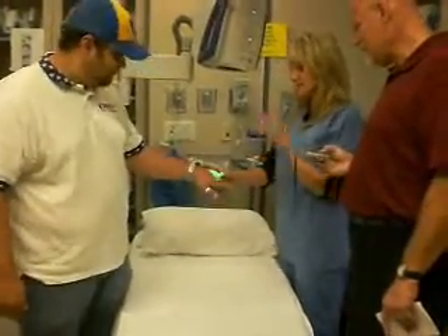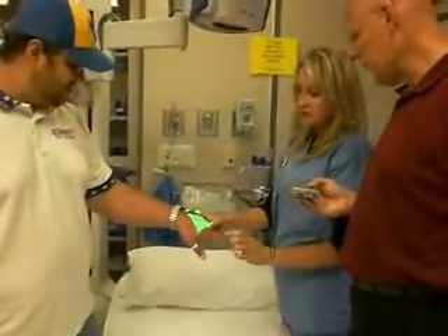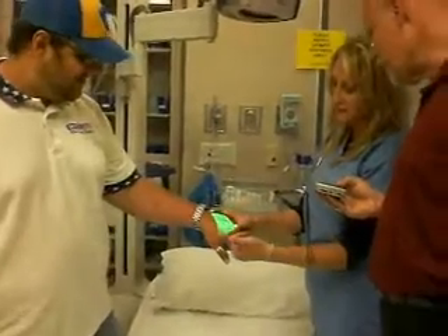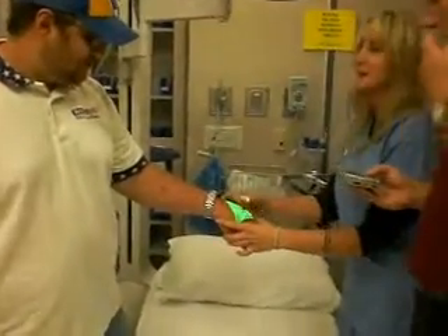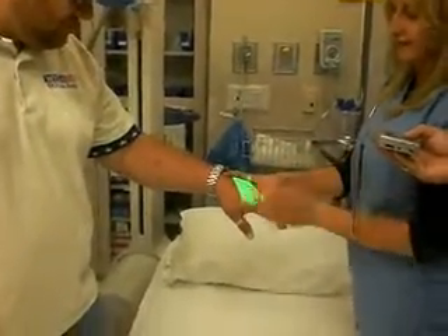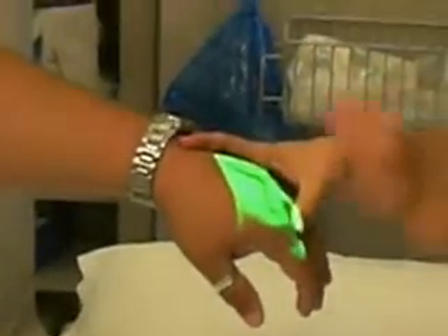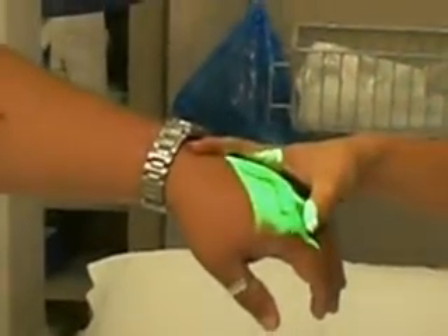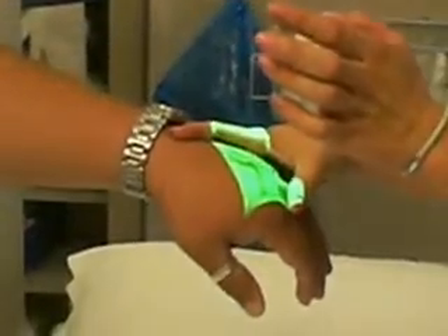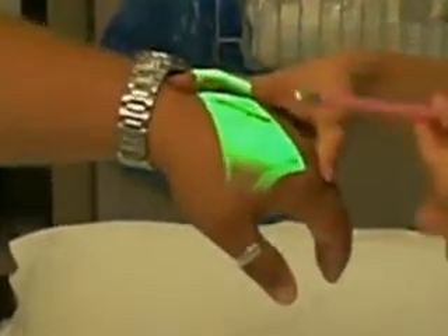This uses near-infrared light, and near-infrared is absorbed by hemoglobin. You can see these dark lines — that's blood. Anywhere you've got blood pumping, we can see it in real time and find the vessels. We can also assess blood flow, which is very important because not all vessels have good flow. If you start an IV in one that doesn't, you may have to restart. So you find one with good flow, bring your needle, and put it right in because you can see what you're doing.